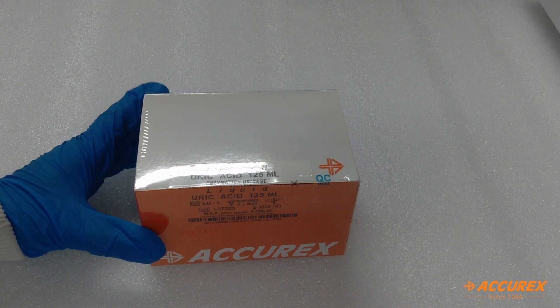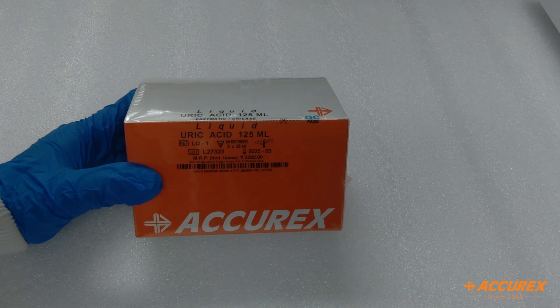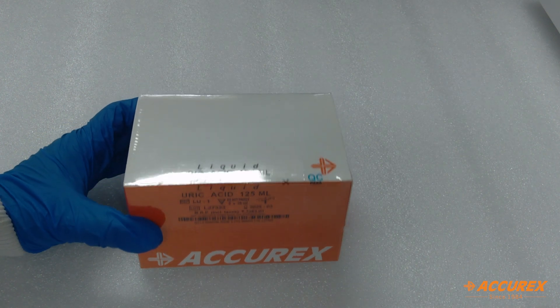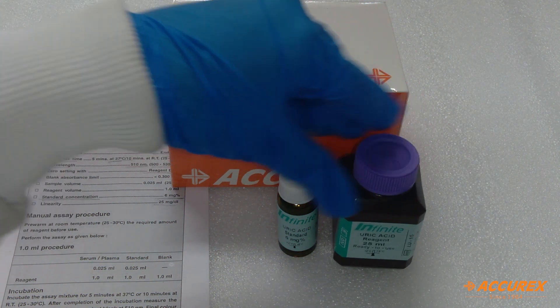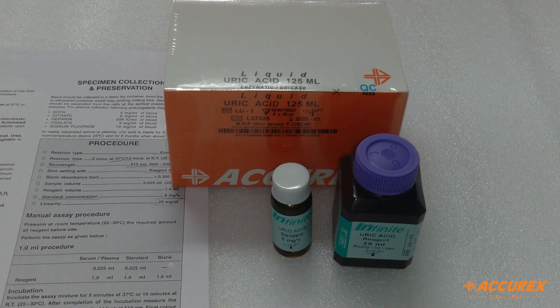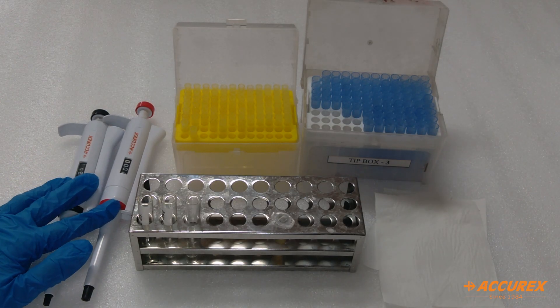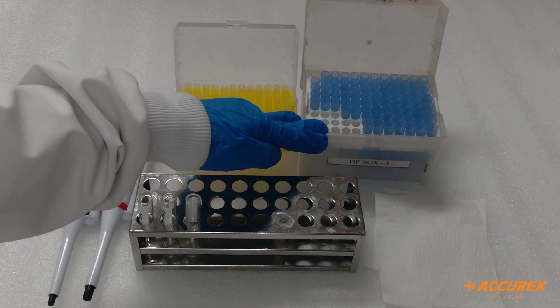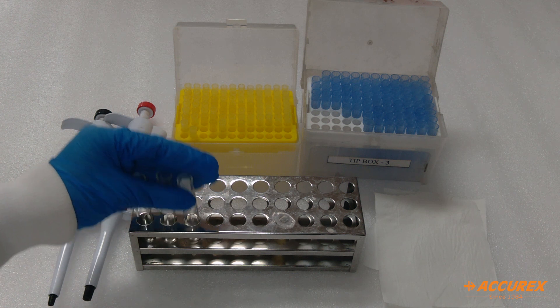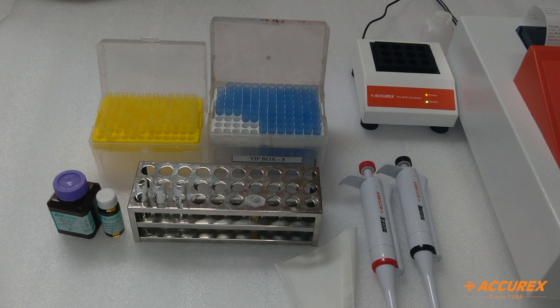Hello everyone, welcome back to Acurex YouTube channel. Today we'll see how to use Infinite Uric Acid on a semi-automated analyzer. In this kit we get reagent, standard, and packing set. Apart from the kit, we need well-calibrated pipettes, small and large tips, labeled test tubes, serum sample, and tissue paper.